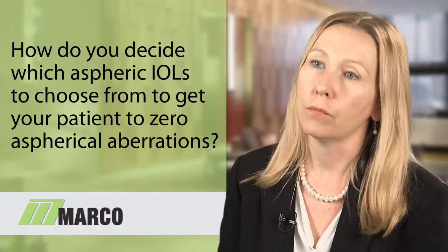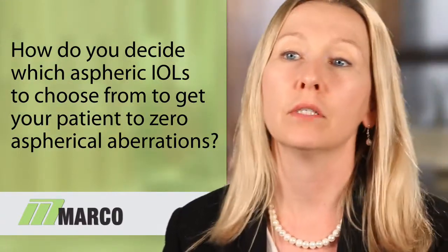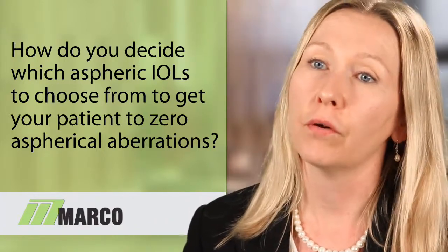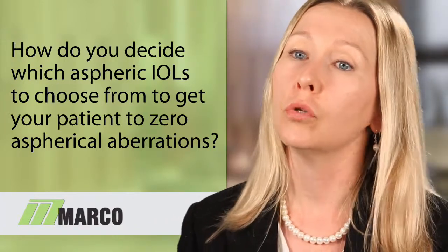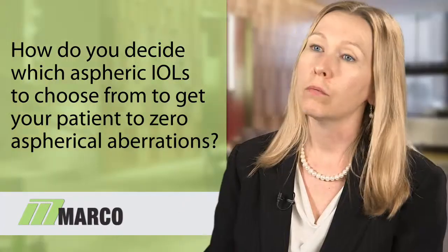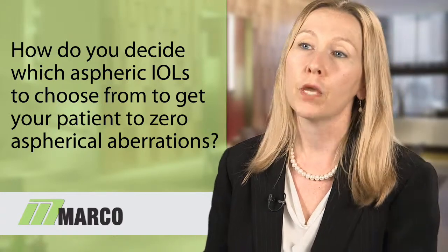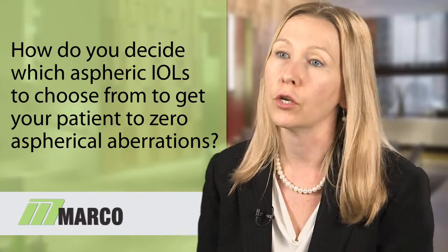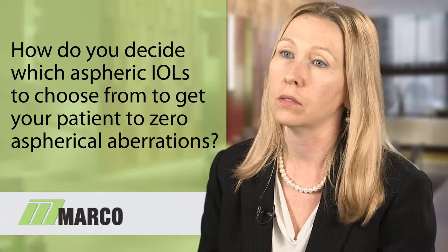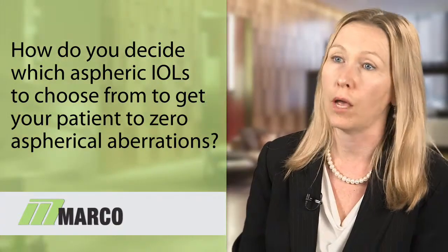In our practice, we use the OPD to customize the aspheric lens to each patient. The reading we get from the OPD we use to determine which implant is best for each patient. So we may use an implant that is spherically neutral for patients who do not have a lot of positive spherical aberration, or we may use an implant that has a high negative asphericity for patients who have a lot of positive spherical aberration to try to neutralize that. So every patient gets a customized implant for their amount of spherical aberrations.